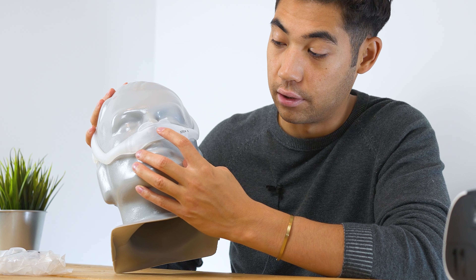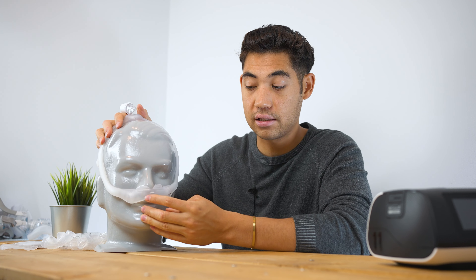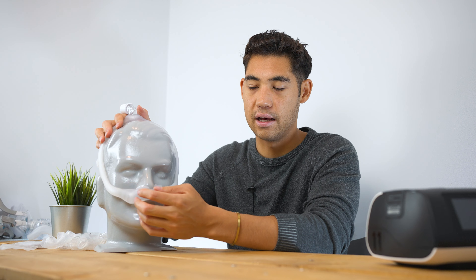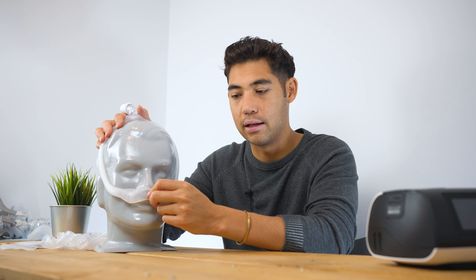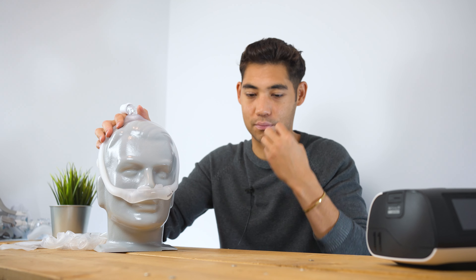Going around, you have these little arms that go totally around the ear — big win for Philips with this. A lot of masks just cut straight across, and I'm not a fan of them, especially if you have higher ears. Something that arches around the ears is great if you have larger or higher ears. The arms go around and then this sits at the back of the head, which is a more firm place to sit. Win-win for the arms and this placement.